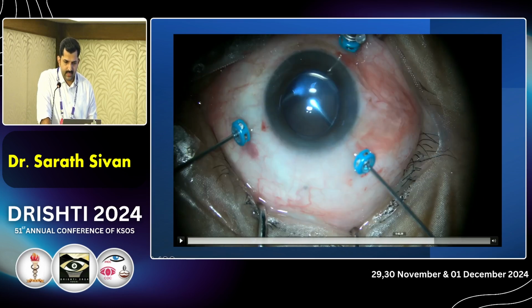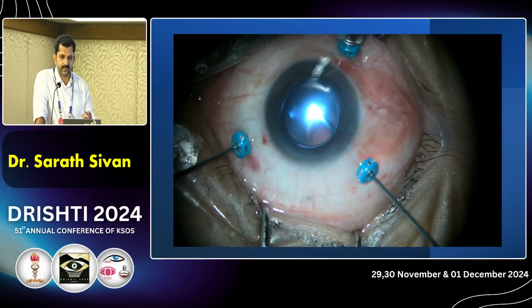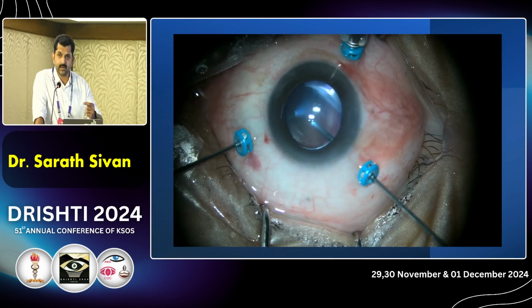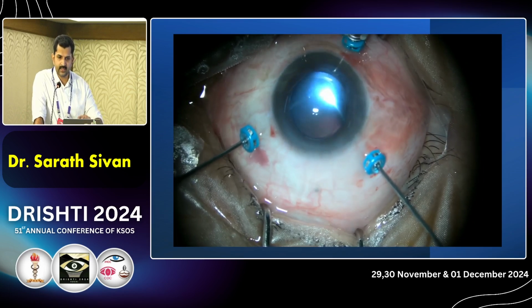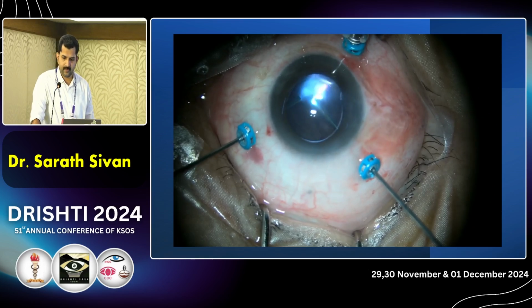Now you can safely cut the anterior hyaloid without any fear of lens touch. While cutting the anterior hyaloid, it is better to keep the cutter facing sideways or downwards. With this, you will avoid cutting the capsule.